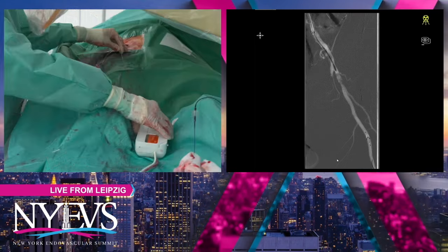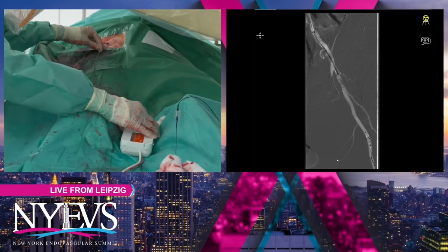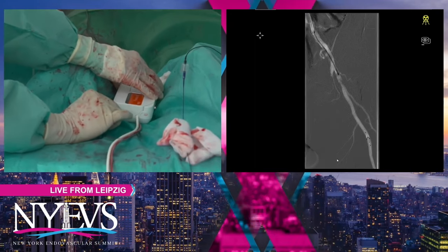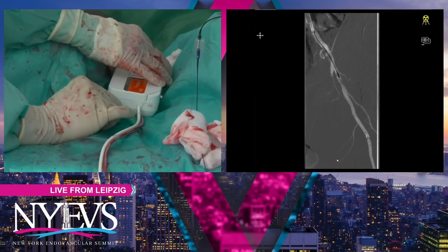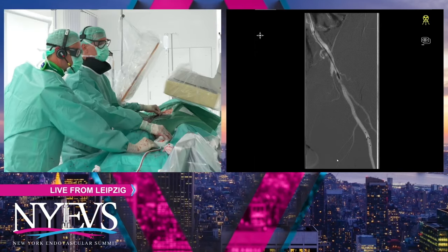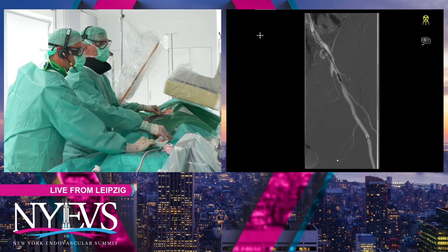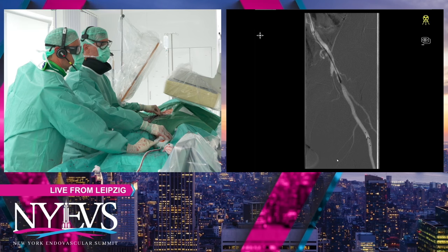Maybe the others can weigh in on, since this is being tackled from an endovascular approach, there's obviously different ways to do this. We've talked a lot about IVL and the thickness of calcium and calcification, like Dr. Finelli brought up in yesterday's breakout sessions. Would IVL work here, given the coral reef, dense calcification? We don't have IVUS findings yet. We don't know how thick it is. Lawrence, Dan, anybody?